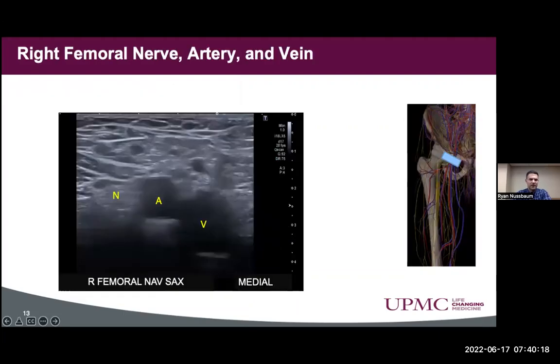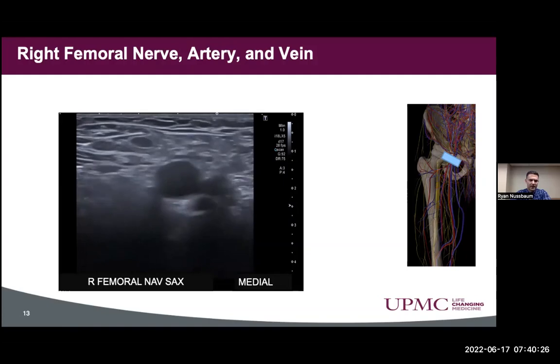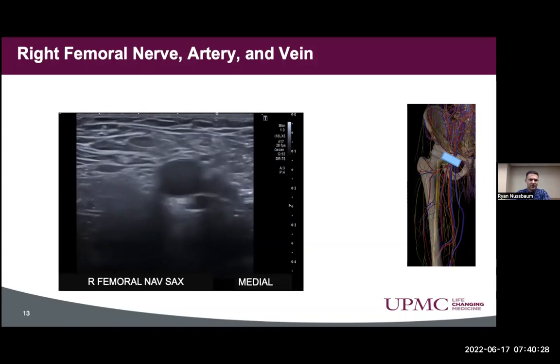Next, we looked at the femoral nerve, artery, and vein. We used a little bit of compression, which can help differentiate the artery from the vein and can also help better visualize the femoral nerve. All of these structures appeared normal on review.